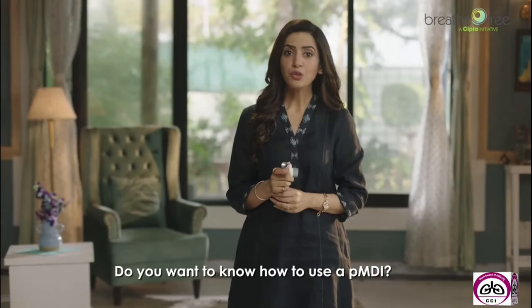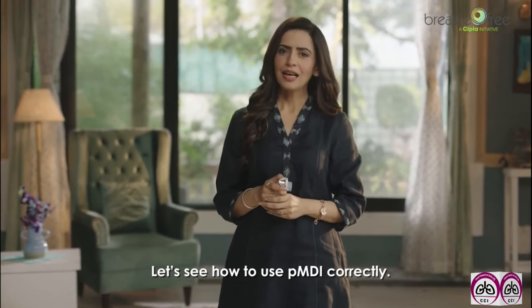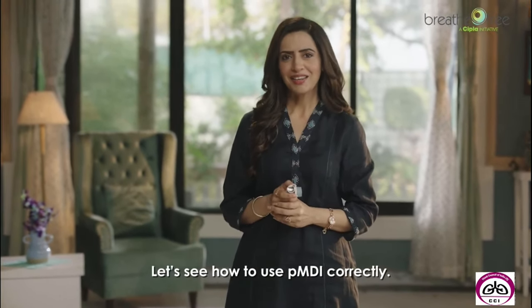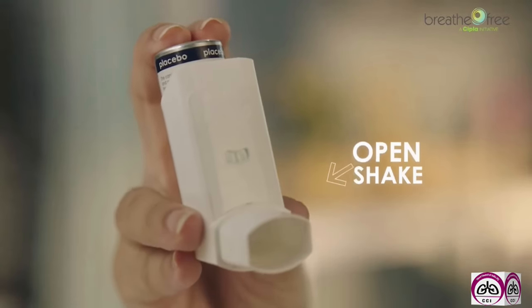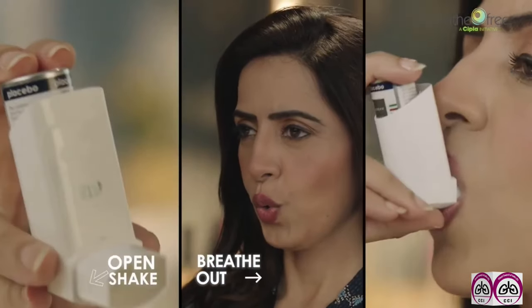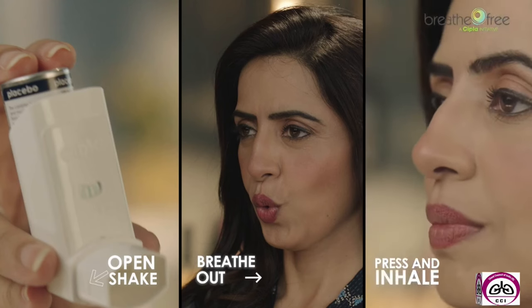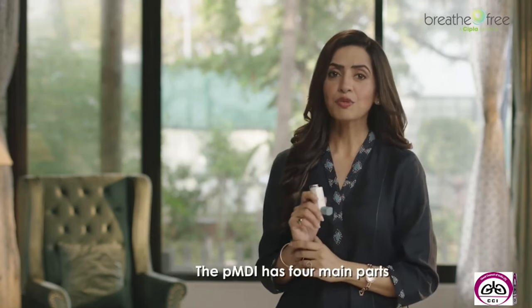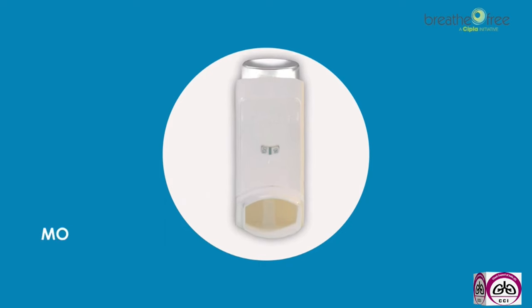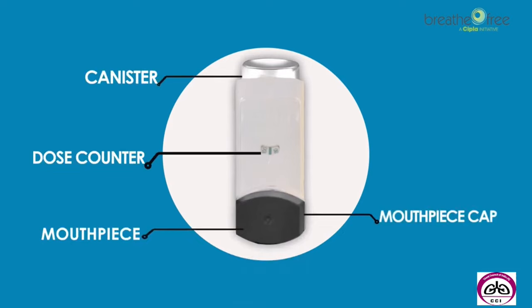Do you want to know how to use a PMDI? Pressurized metered dose inhaler. Let's see how to use PMDI correctly. Just remember these three steps. Step 1, open and shake. Step 2, breathe out. Step 3, press and inhale. Let's understand parts of the inhaler. The PMDI has four main parts: a mouthpiece, mouthpiece cap, dose counter, and a canister.